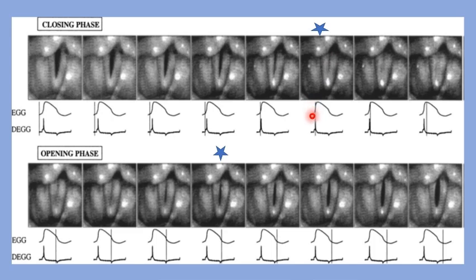You could see this segment of rapid change in the glottal area waveform and the very high positive peak in the time derivative. And then the closed vocal folds would remain closed for some time before starting to open up again in here. This would mark probably the end of the closing phase, when there is deceleration and the movements of the vocal folds to peel apart, opening up the glottis in this frame in here.